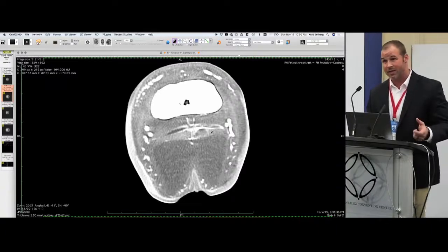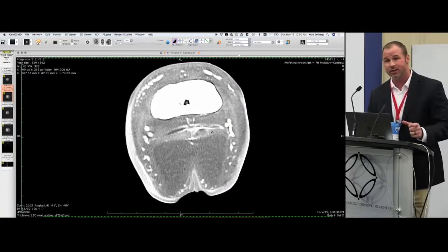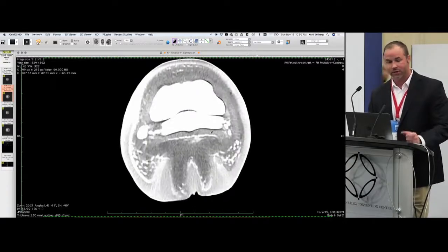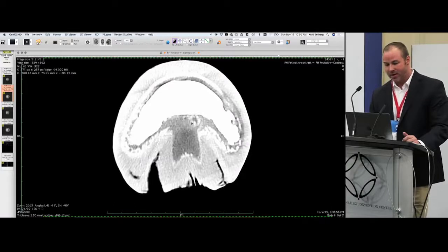But intrasynovial structures we can see very well. We can put contrast within the distal interphalangeal joint, the fetlock joint, and look for surface abrasions within our patients that we take to CT, but we're not going to see those intrasubstance cartilage lesions in the CT patient. So just a difference in looking at MR versus CT, and that's not really what we're here for. We're really just looking at CT.